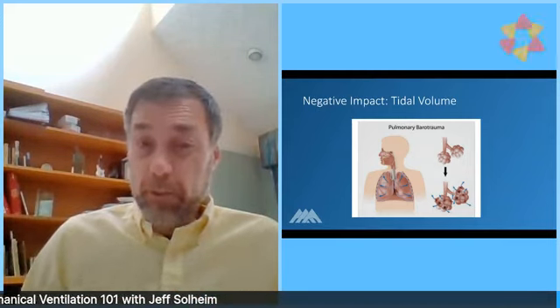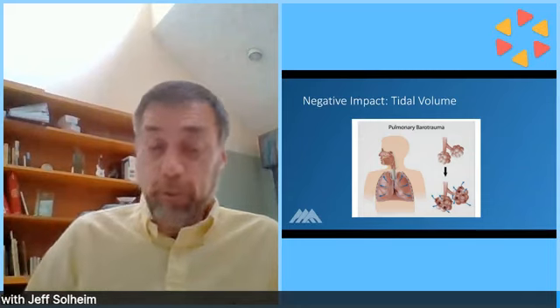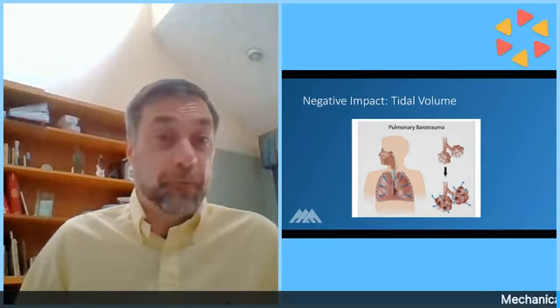Now, how does this relate to COVID? Because we know that COVID causes an ARDS-like syndrome, an acute respiratory distress syndrome, and that stiffens the lungs. So people who have full-blown COVID and are in respiratory failure, their lungs are stiff. And using higher tidal volumes may not be an option, because if you stretch those stiff alveoli, you can rupture them and cause pneumothoraces and other problems. So tidal volume is a little bit limited.